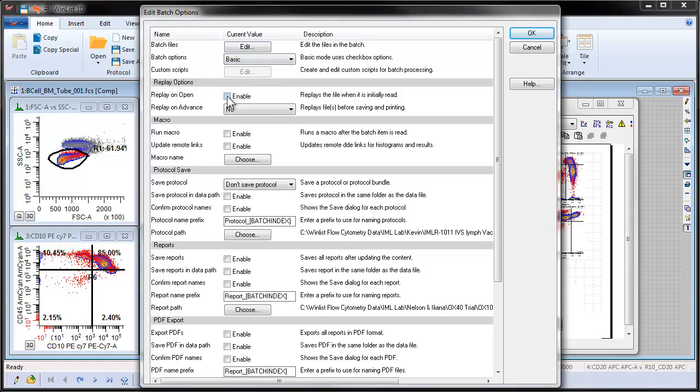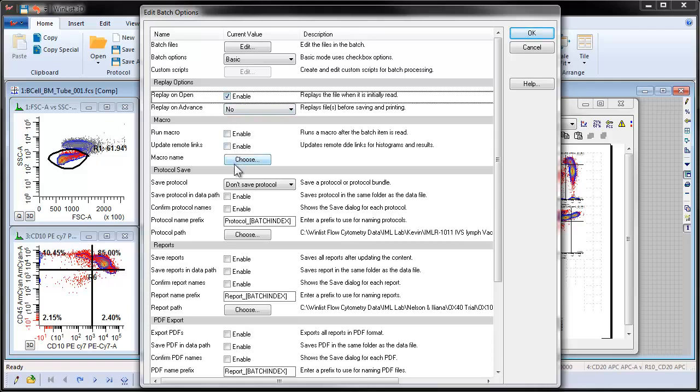For example, we may want to enable Replay on Open to read the entire data file when it's opened. When done with the selection, click OK to close the dialog.